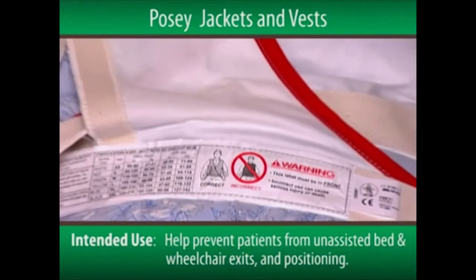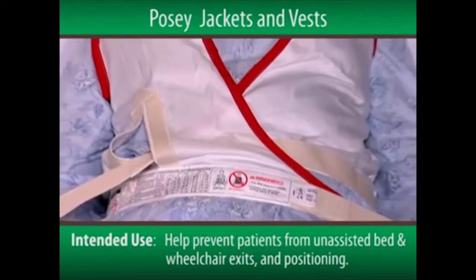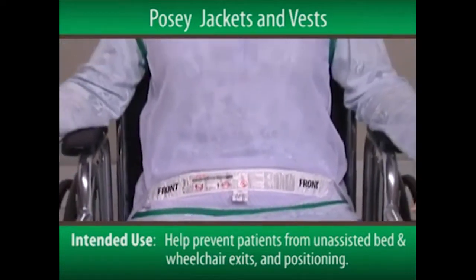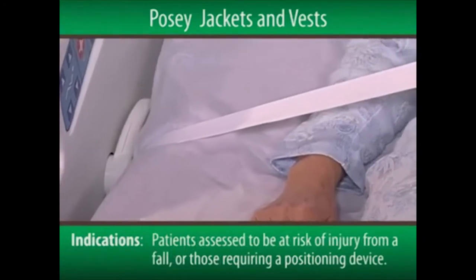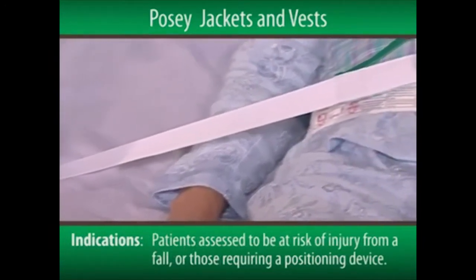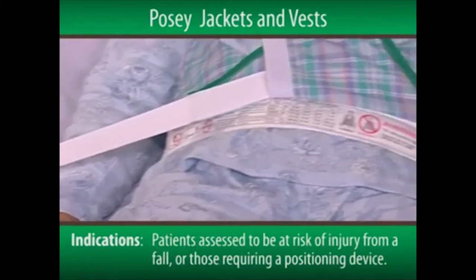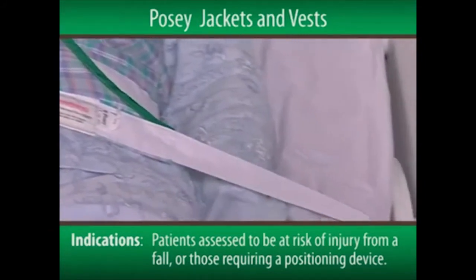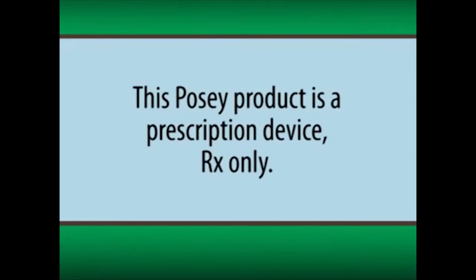The Posey jackets and vests are used to help prevent patients from unassisted bed and wheelchair exits and positioning. They're indicated for patients assessed to be at risk of injury from a fall, or those requiring a positioning device to assist medical treatment. It's important to note that this Posey product is a prescription device, Rx only.